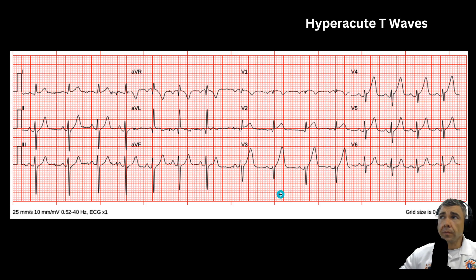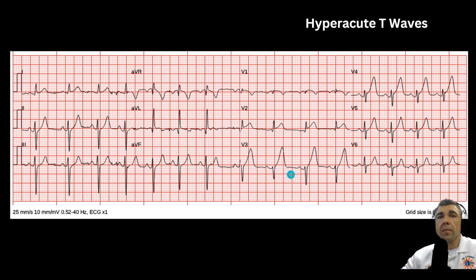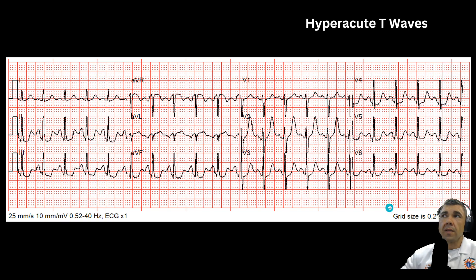Here's another example where the T-wave height really stands out because the QRS complexes aren't as big, and you still get nice, tall, symmetrical T-waves before the elevation occurs. This is early in the MI, which is good in a sense — the earlier you identify an MI and treat correctly, the more myocardium — the more heart muscle — you're going to save. The whole idea is to keep that tissue from becoming necrotic, which is irreversible damage.